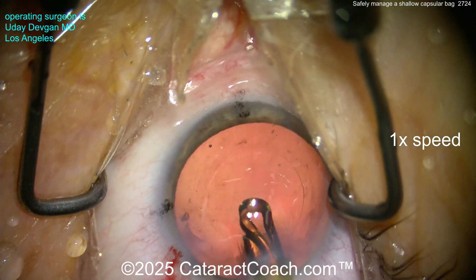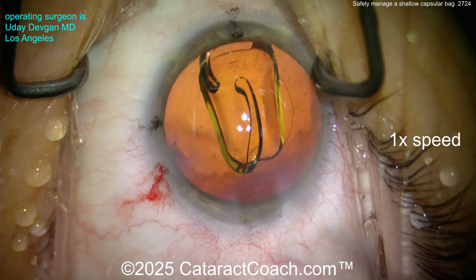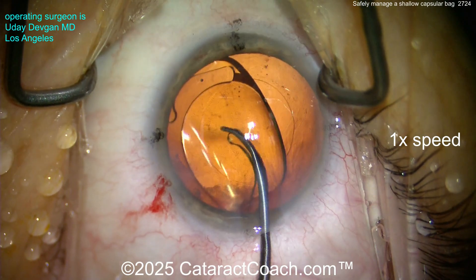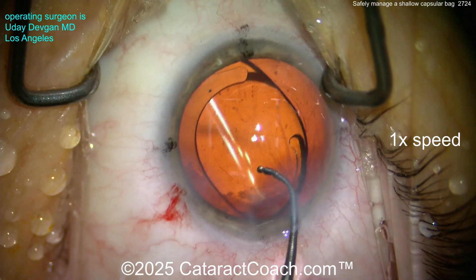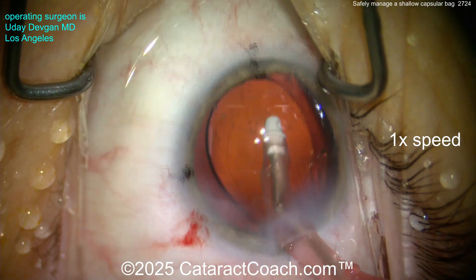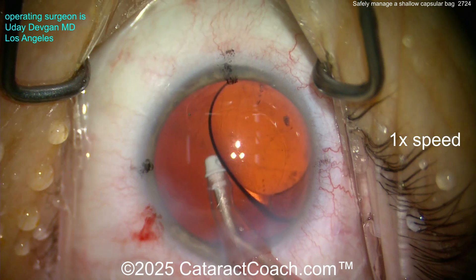I polished up the anterior surface of the capsular rim and now delivering the IOL into the eye. You can see the bag is pretty shallow, so this case struck me — I need to be careful. Opening up the capsular bag enough to get the lens in. You can see it's a good rhexis covering the edge of the optic 360 degrees. Looks like a monofocal or toric lens. Now going behind it to remove the viscoelastic.